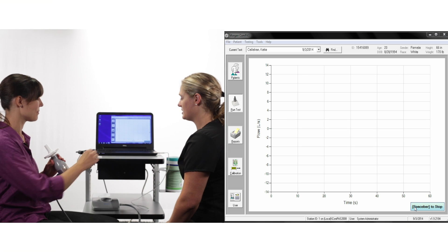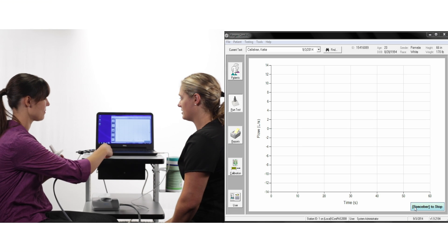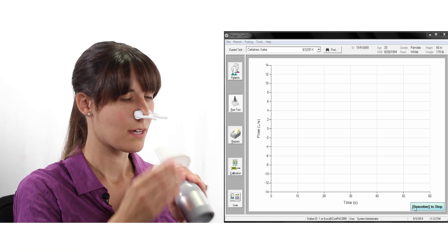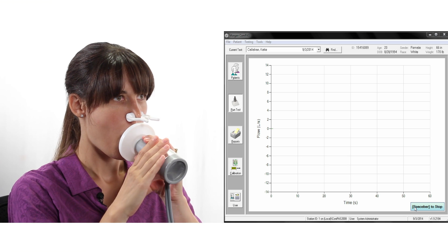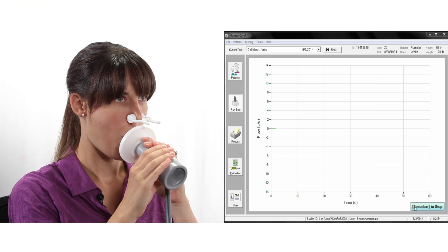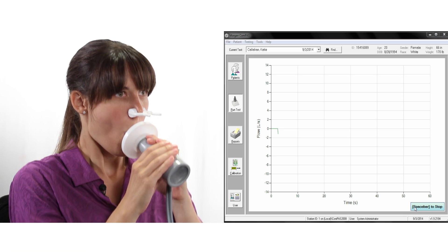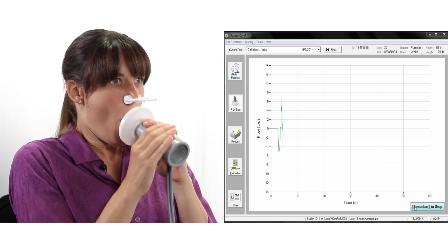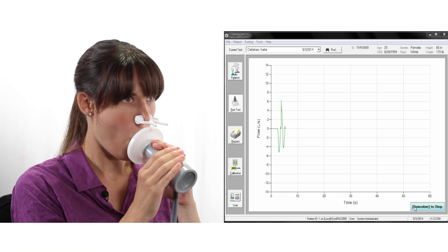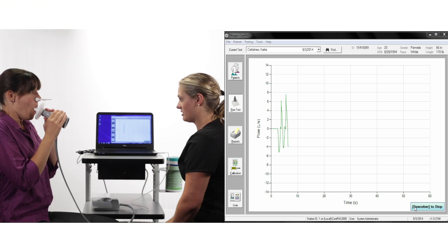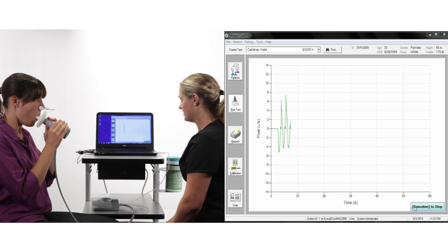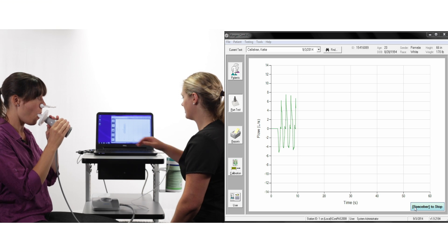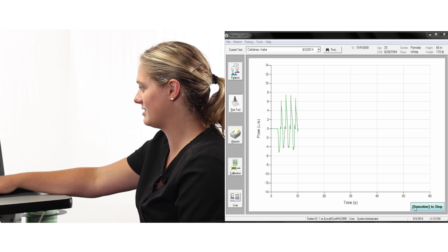The space bar begins the test, with the screen showing a graphic of flow versus time. Encourage the subject to breathe normally, then instruct them to breathe in and then cough with maximal effort.